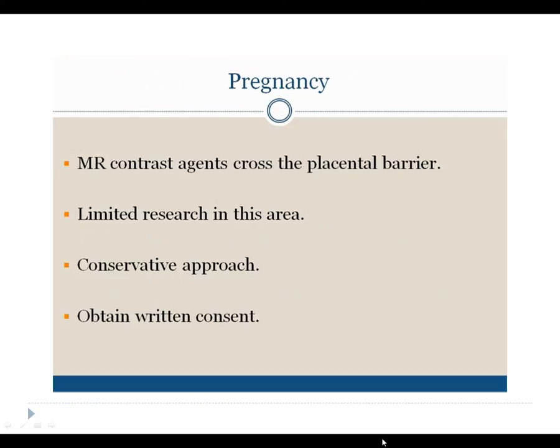If it is decided to use MR contrast agents, and this would be determined by the radiologist in conjunction with the patient's referring physician, written informed consent is needed, stating that the risk associated with the use of MR contrast agents during pregnancy is not currently known.